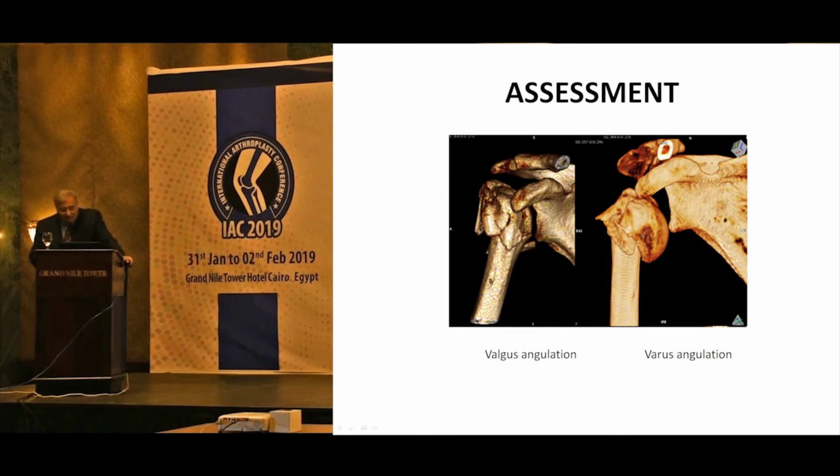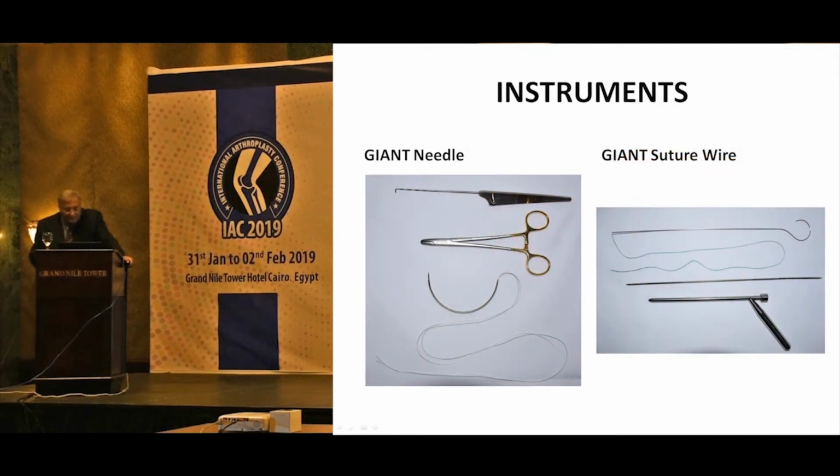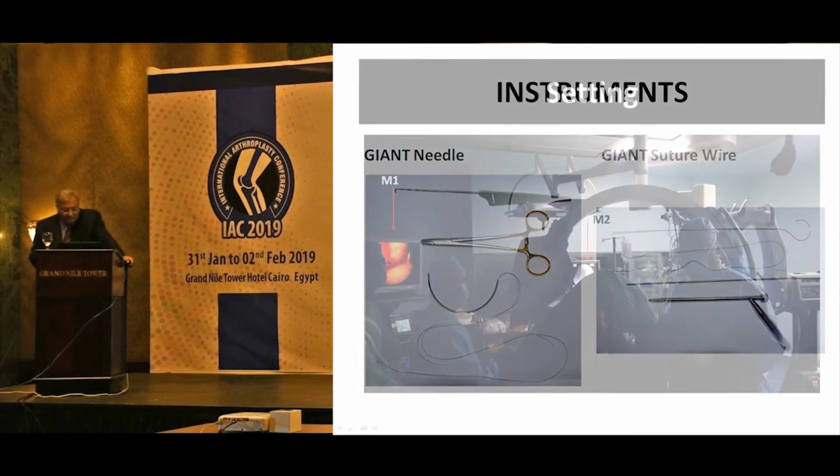First, we have to assess the fracture. Is it with valgus angulation of the head or a varus angulation of the head? The instruments we use are the giant needle with a special suture, and a new device we call the giant suture wire, which is composed of a wire and a suture added to it, a guide, and we also use K-wires, of course.